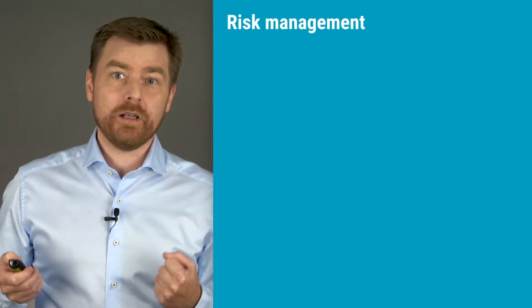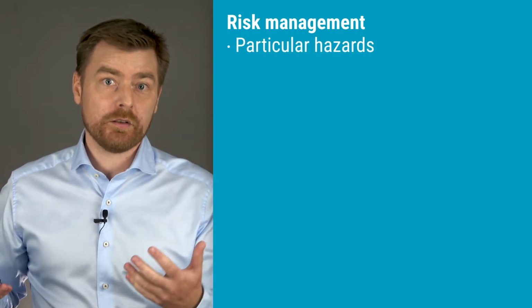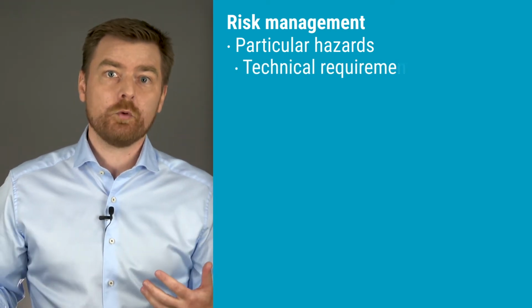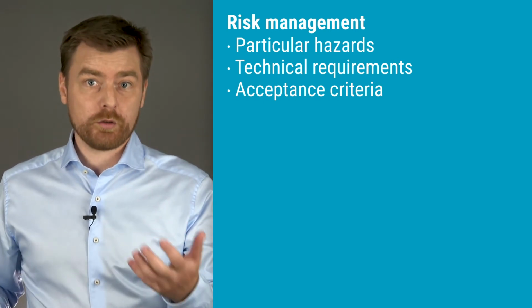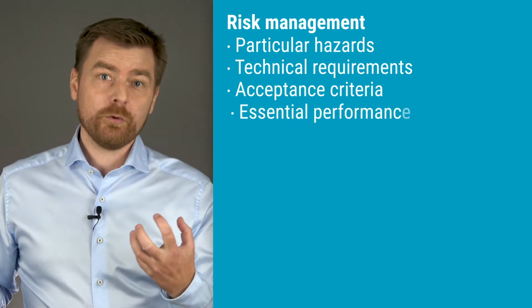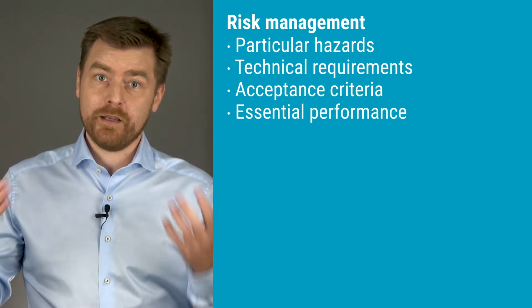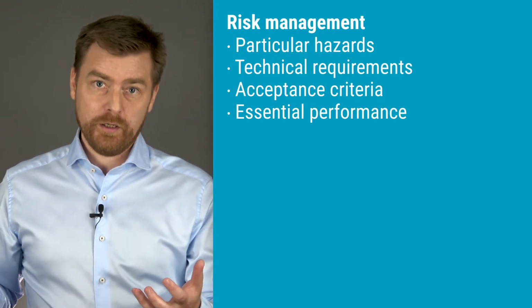I have already covered some of the requirements related to risk management. Remember to evaluate the adequacy and suitability of particular hazards, technical requirements, and acceptance criteria through your risk management process. Also, the risk management process shall be used to identify essential performance, which we defined earlier.